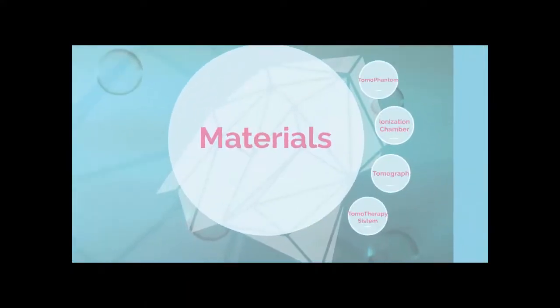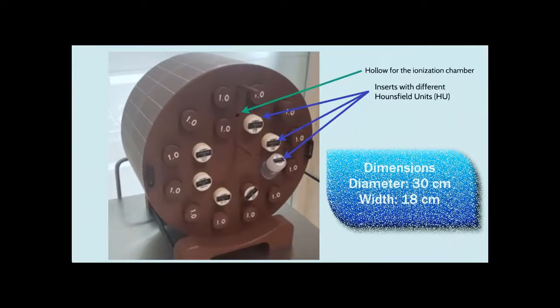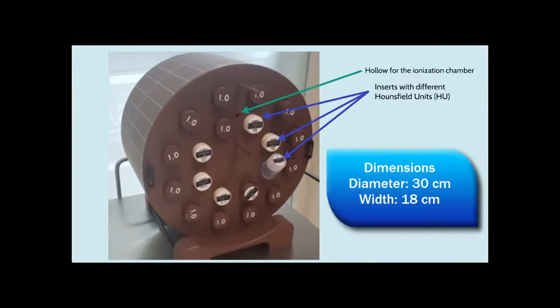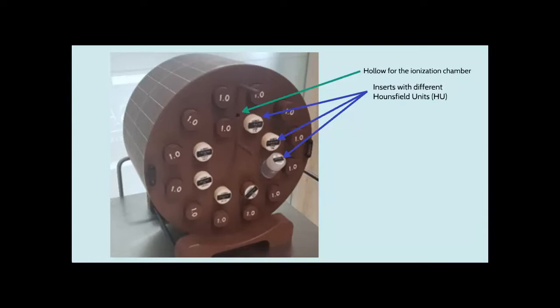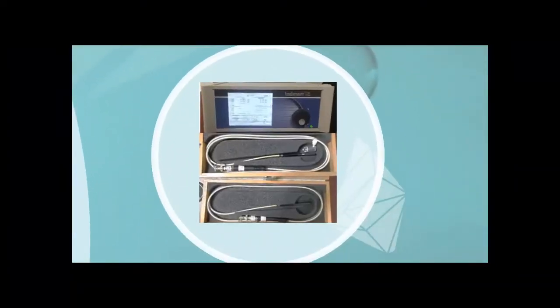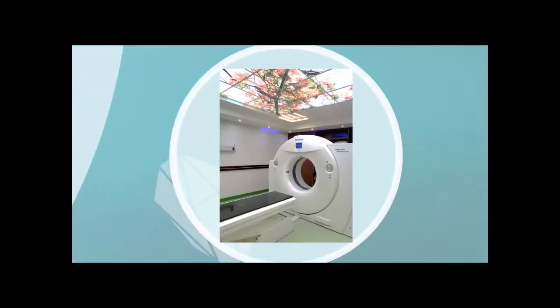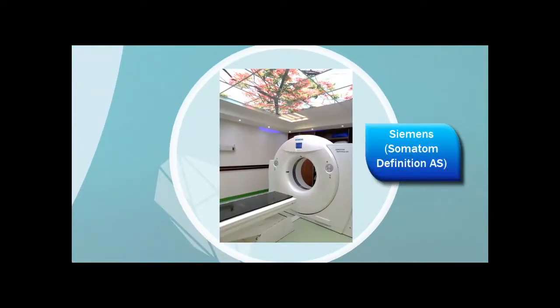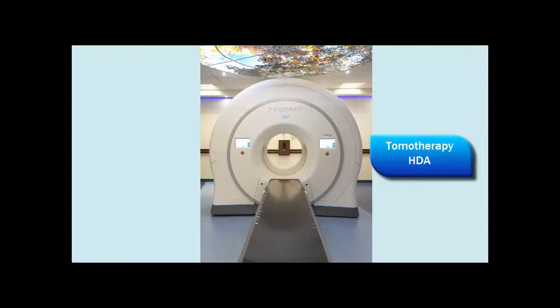Materials: the tomophantom, which is basically our patient where the ionization chamber is located, and it consists of various inserts for different HU, or Hounsfield units. We are going to use an ionization chamber, A1SL, with its respective electrometer. We have a tomograph simulator, and finally, our tomotherapy equipment.